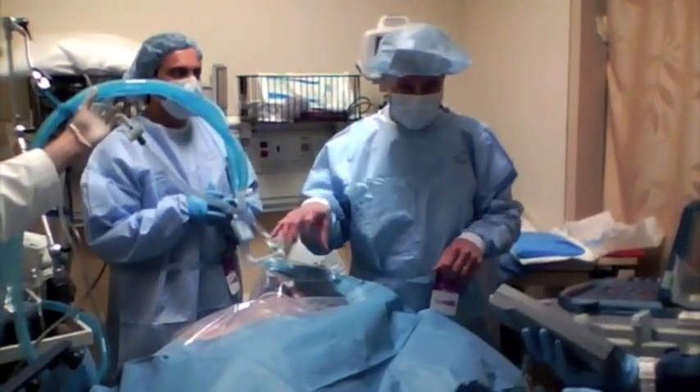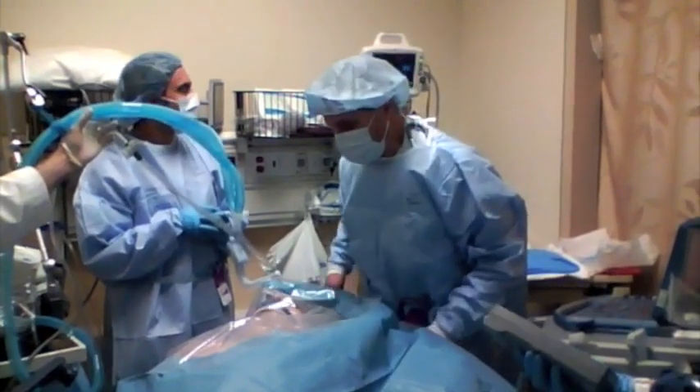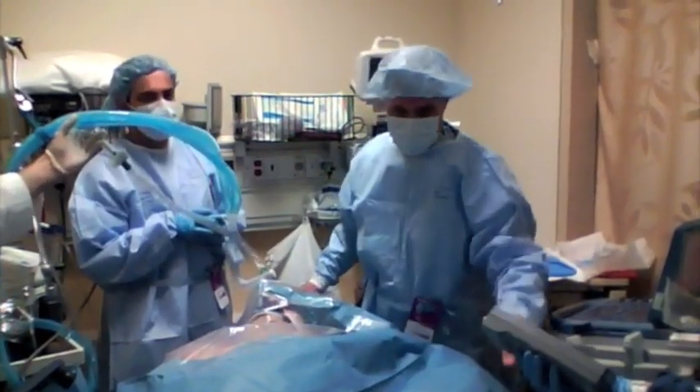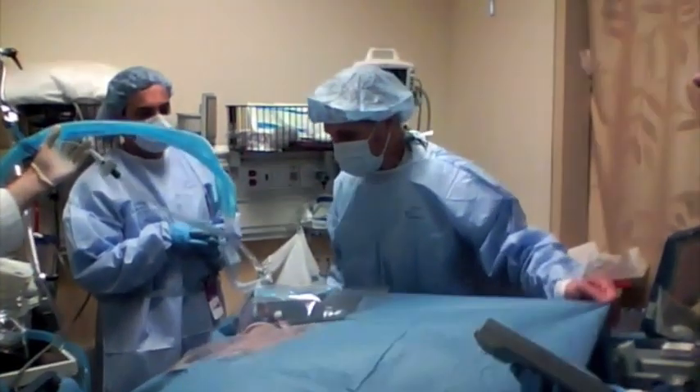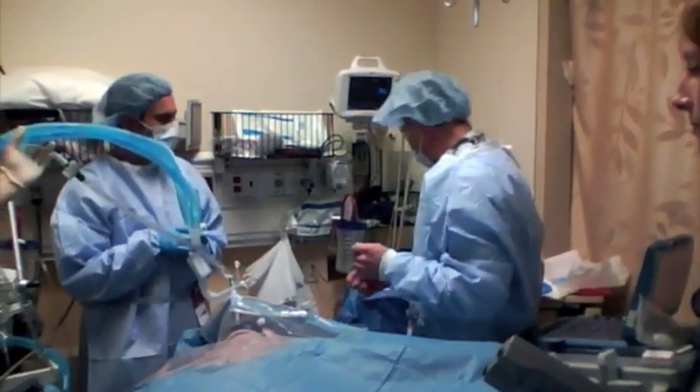What we're going to do is put a transvenous pacemaker in this gentleman. He's got symptomatic bradycardia, and we're going to go through the right internal jugular on him. We've already scouted the vein out and it looks good, so we should be able to slip it in there with no problem.